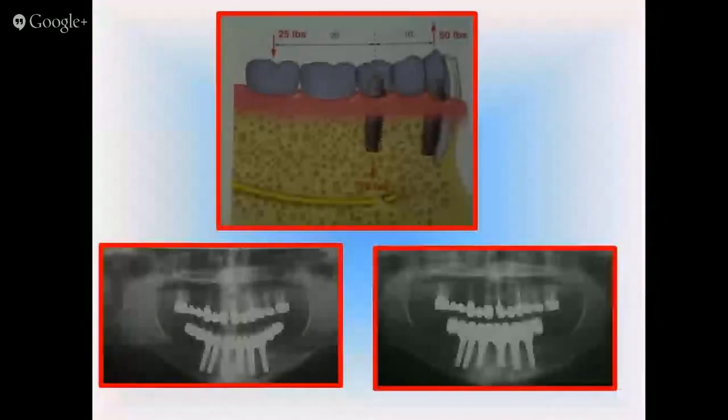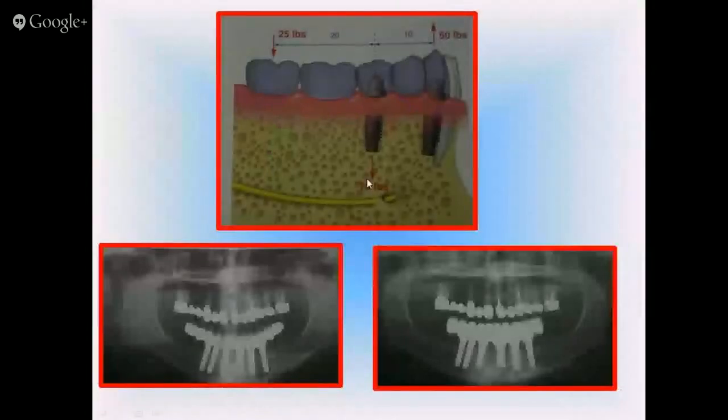So if the distance between my distal most implant and the implant lying in front is, say, about 5, then multiplying that by 1.5, that is 7.5. I can extend my distal most cantilever to the limit of 7.5. It cannot go beyond that, because after that it will start getting overloaded. We'll come to that.